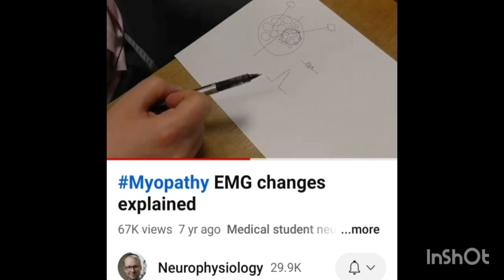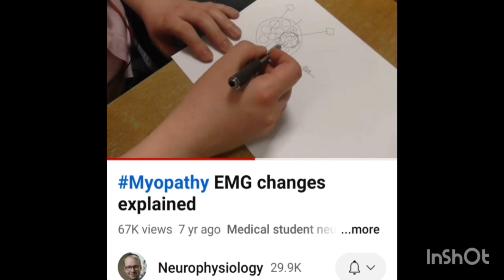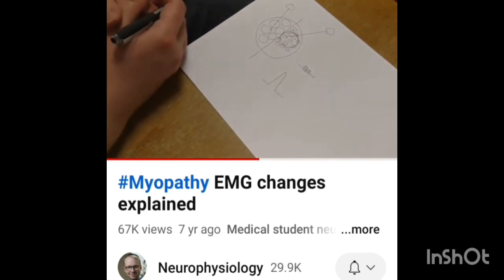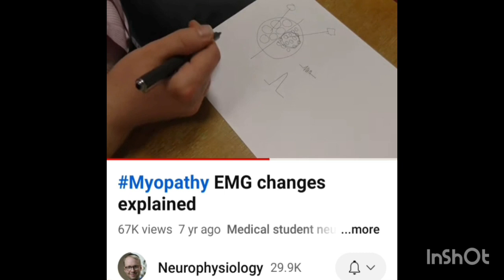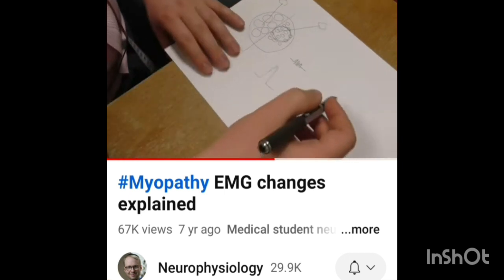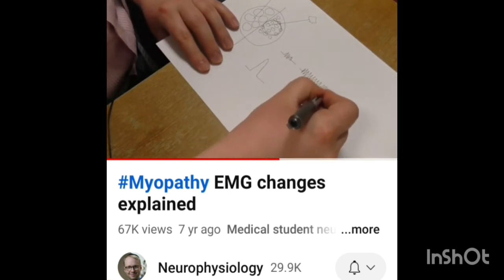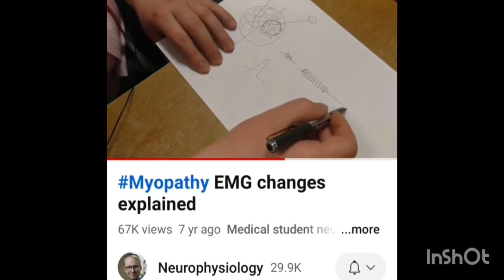Lots of signal driving the muscles to squeeze is going to occur, and so we're going to be driving these small shrunken muscle fibers as hard as possible in order to generate force. Because they're all so small and so weak, they're not going to be generating that force, but it's going to be the equivalent of the brain whipping the muscles into a frenzy to try and generate the force necessary to activate the movement. Hence, when we're looking at how the motor units are recruited, they're not recruiting like in the Henneman principle. Rather, very, very rapidly we are going to get lots of activity that just fills up the screen very quickly. And this is called early recruitment, and we're seeing small polyphasic units.